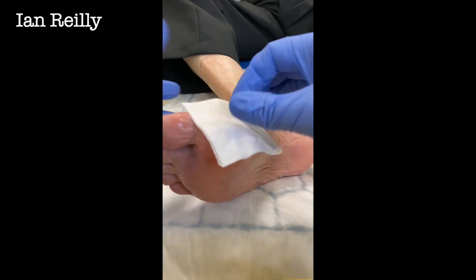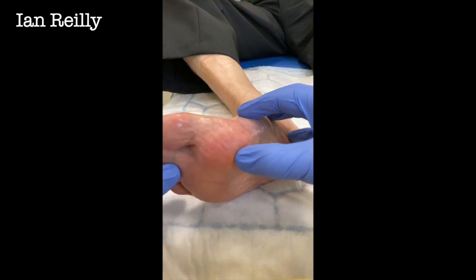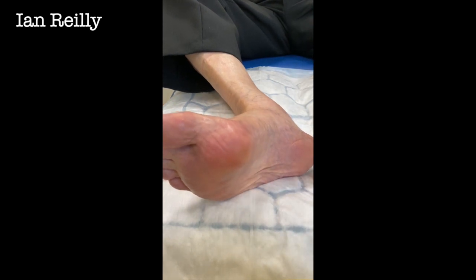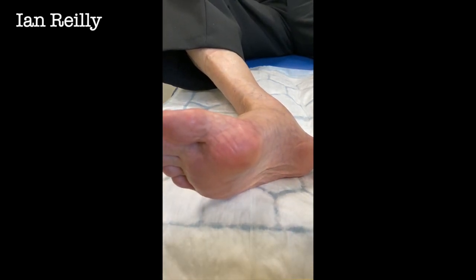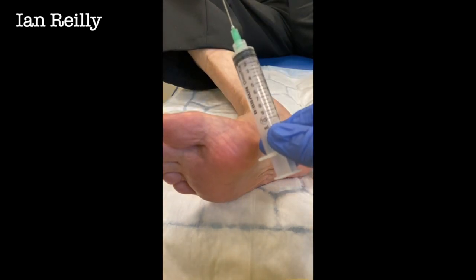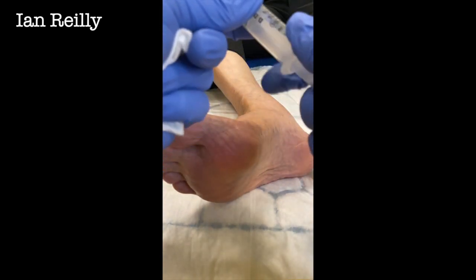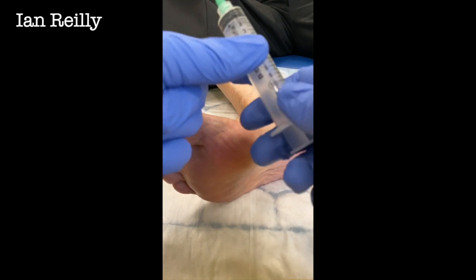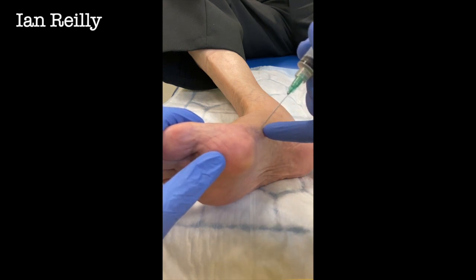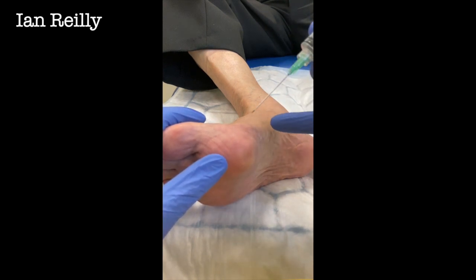Just a little bit of dabbing, and it'd be interesting to see how much fluid we can get off this area. There's going to be a little scratch coming up, sir. Green needle - 21 gauge needle on a 10 mil syringe; if you can get a bigger needle in the biggest range, all the better. Just make sure the needle's nice. There's going to be a wee scratch, as they say in Scotland - one, two, three.